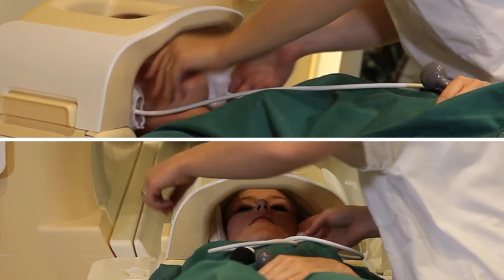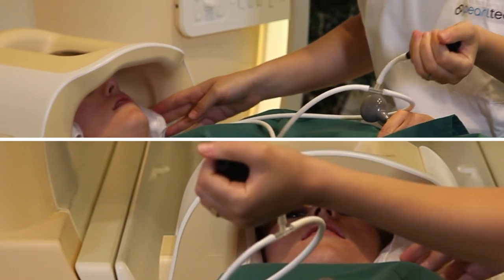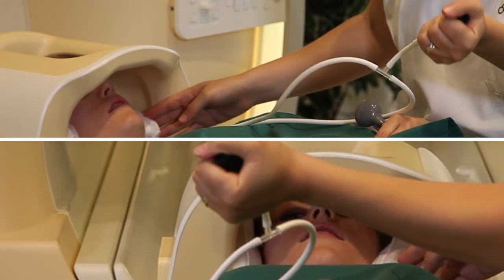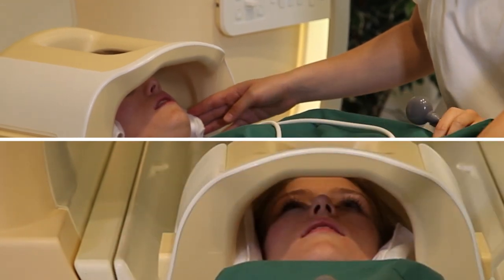Use the simple hand pump to expand the pad and stabilize the patient. The air pressure can be adjusted to your needs and the patient's comfort. Once inflated, place the pump away from the patient call button and the coil.